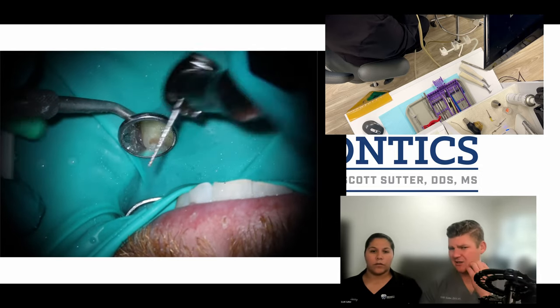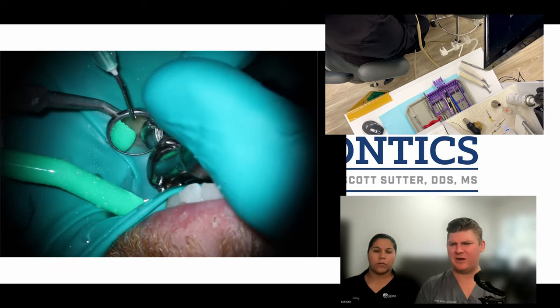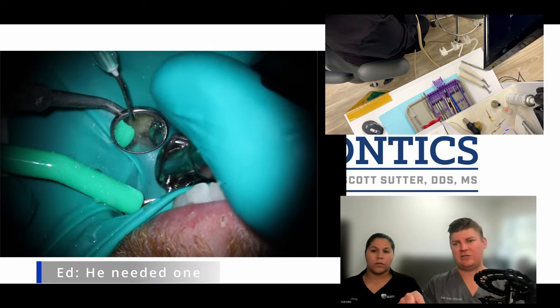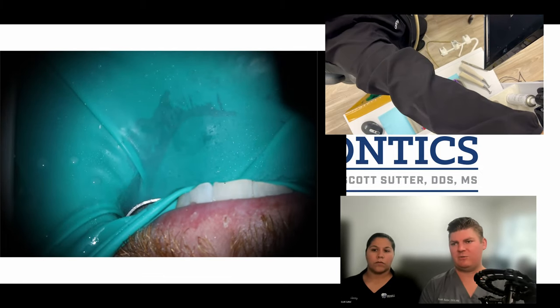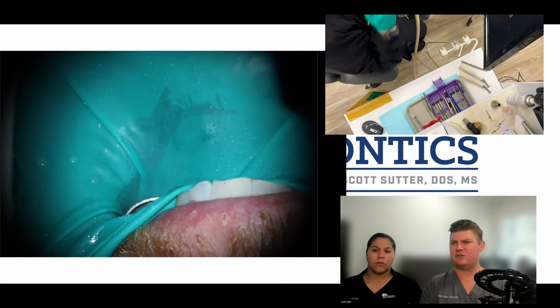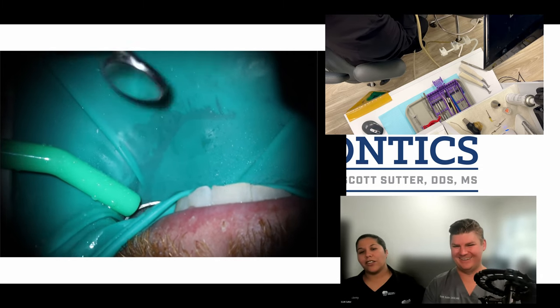I think at this point I switched to a new burr — I don't remember if I needed one on this one — but we do keep extra burrs on Jenny's side, on her right-hand side over the corner, so we're able to grab them just in case. I think we were turning up the music because we liked the song at that point. It's important to have good tunes.